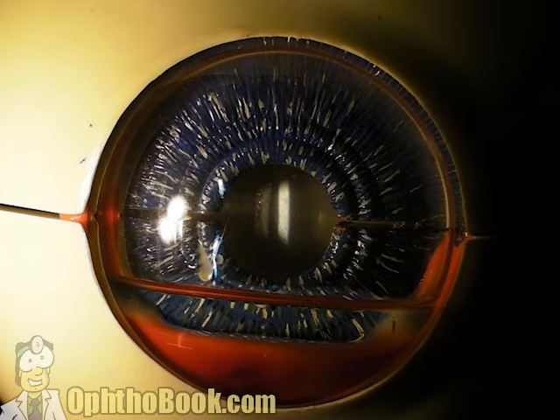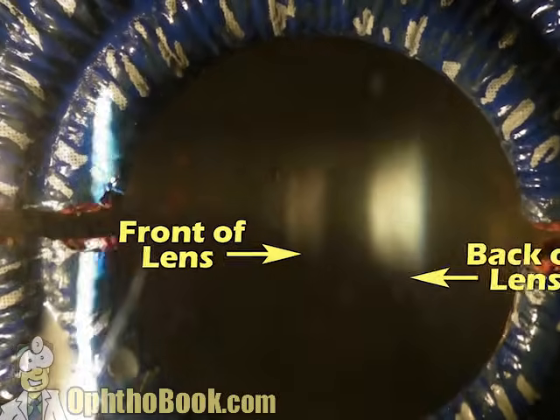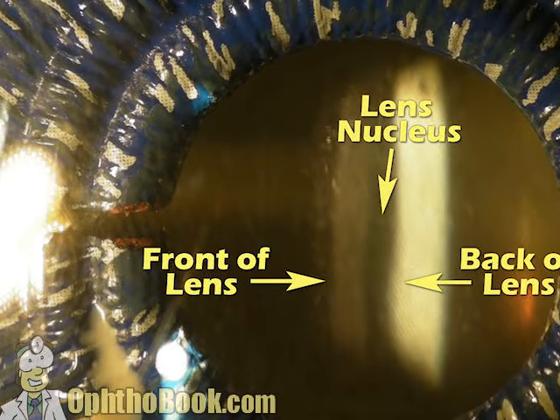So if we zoom in here, you can actually see the front of the lens here, and the back of the lens is here, and the part in between is the lens nucleus. That's where people mostly develop their cataract.